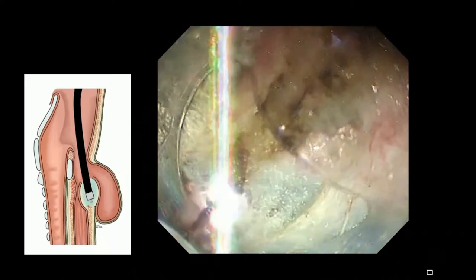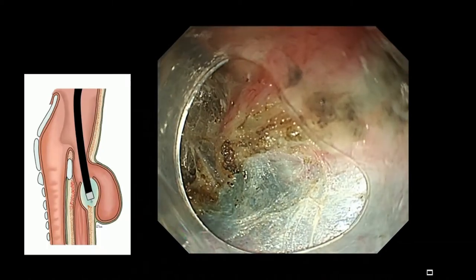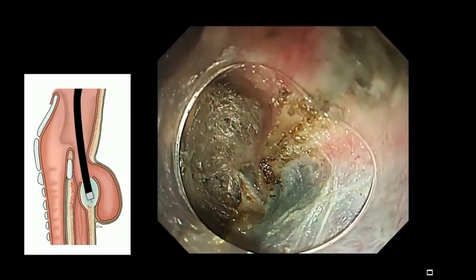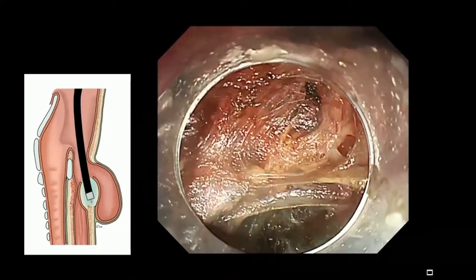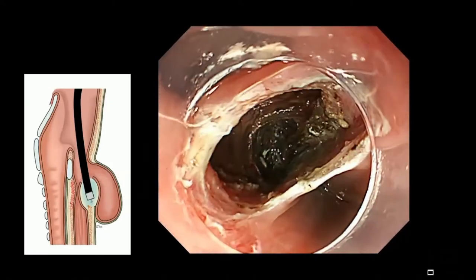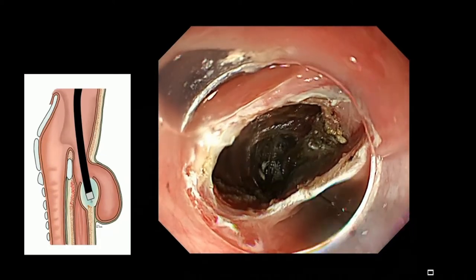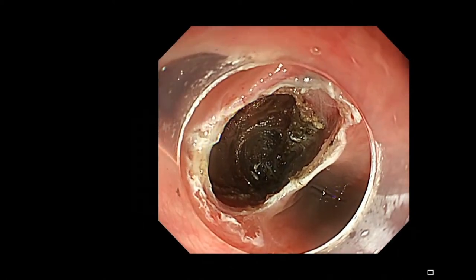Always visual control. Now we are dissecting the muscle fibers using spray coagulation. There are some perforating small vessels, but we have to at least dissect the cricopharyngeal muscle totally, and then we put the endoscope back. Now watching the surrounding tissue — muscle layer has already been cut more than two centimeters.